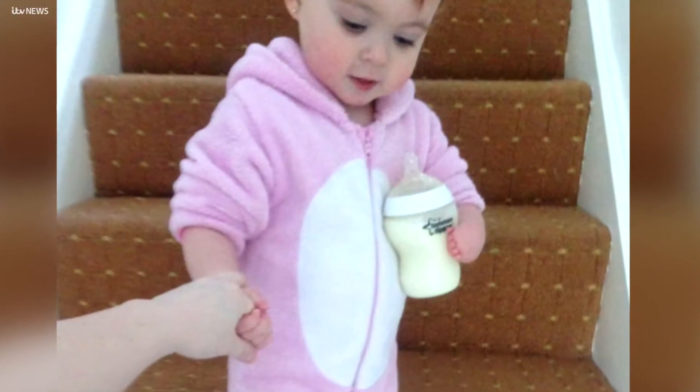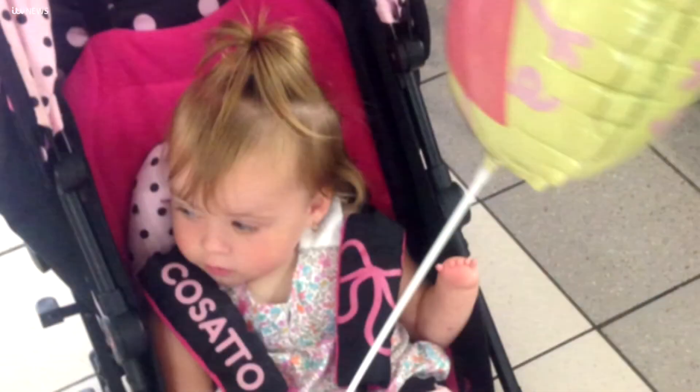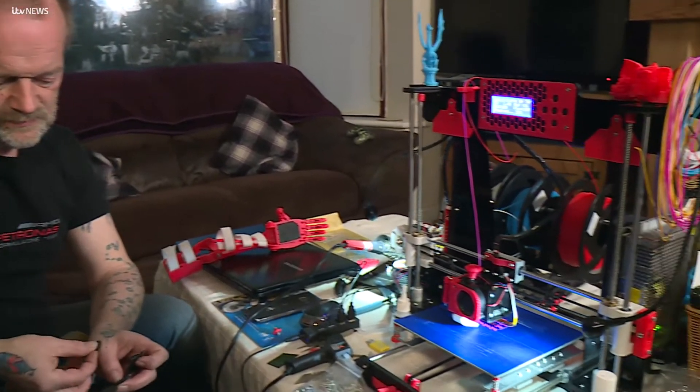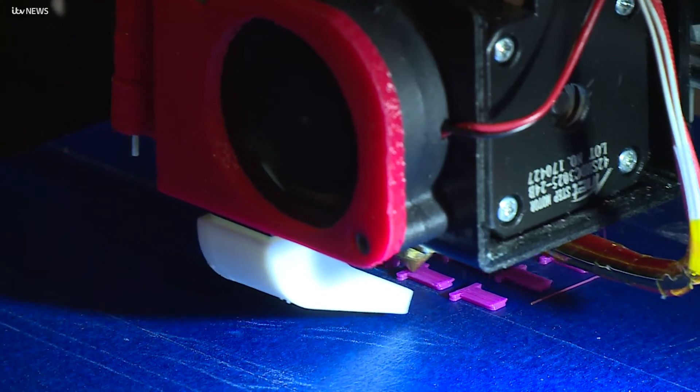Five-year-old Keira was born without a left hand. Doctors had told her she was too young for a prosthetic. After reading her story on Facebook, Callum Miller from Stockton offered to help. He made her an arm using a 3D printer at home — it's something she's going to have to get used to.